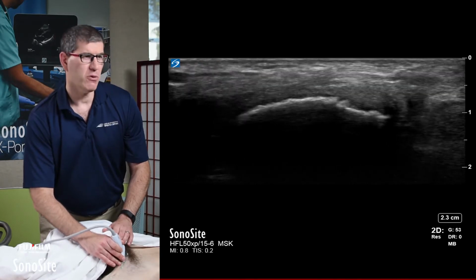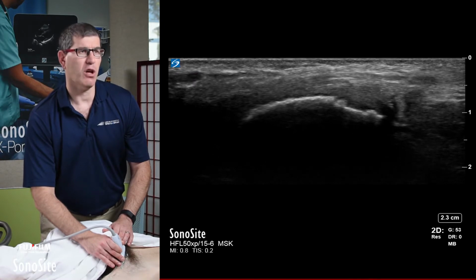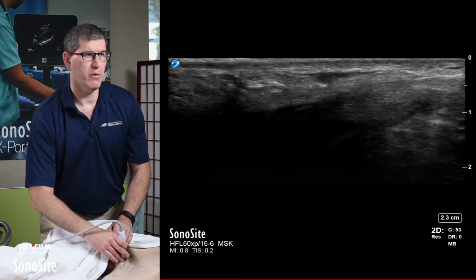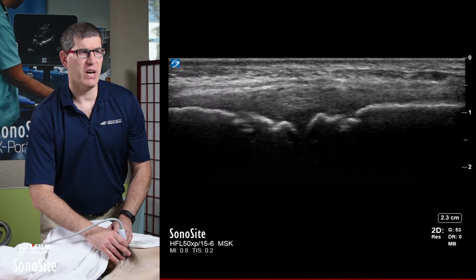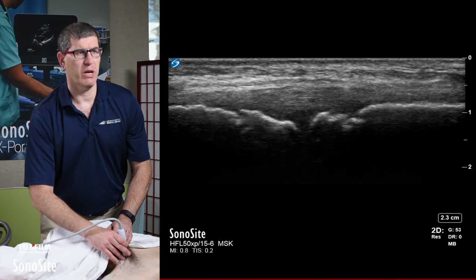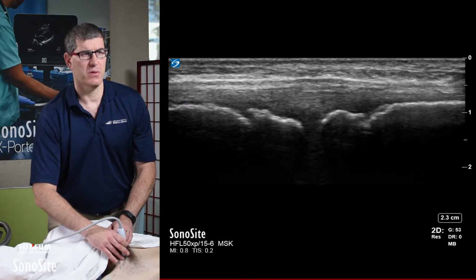As we continue to advance, I'm going to rotate the probe, which right now is in the long axis of the adductor tendons, into a plane that is going to be a transverse view through the pubic symphysis. So here, on the left side of the screen is going to be the patient's right pubic tubercle, on the right side of the screen is going to be his left pubic tubercle, and then we can see the symphysis pubis.